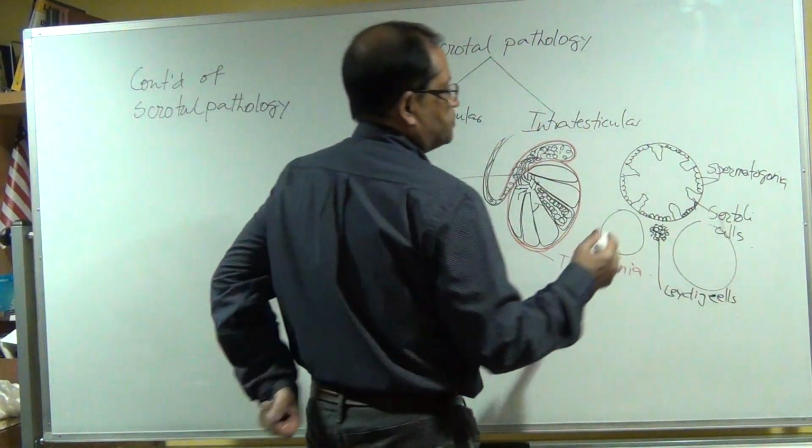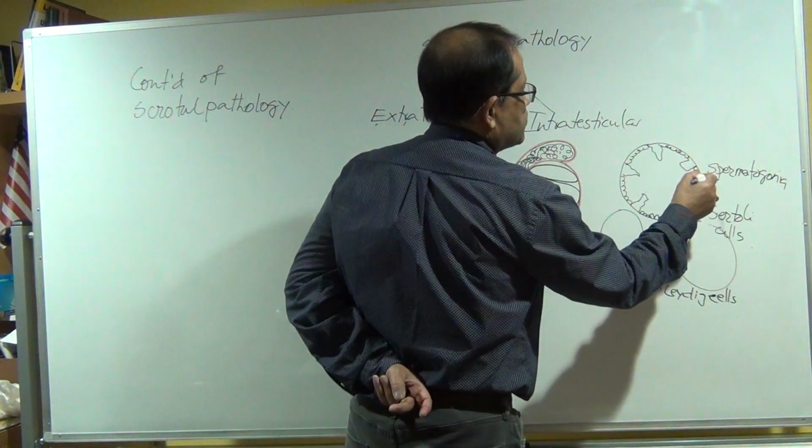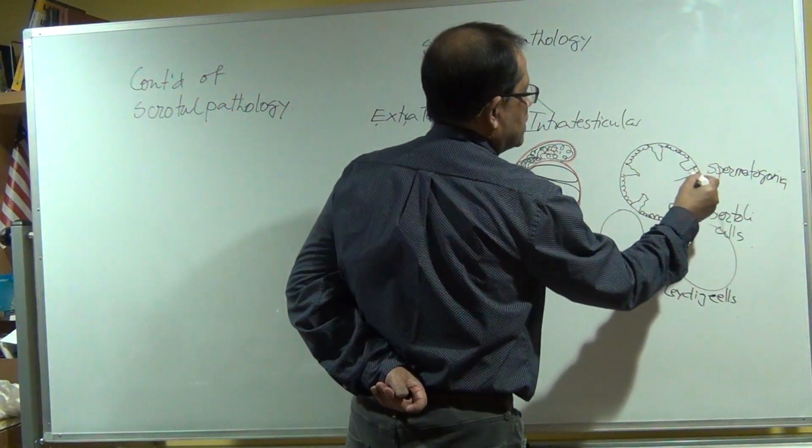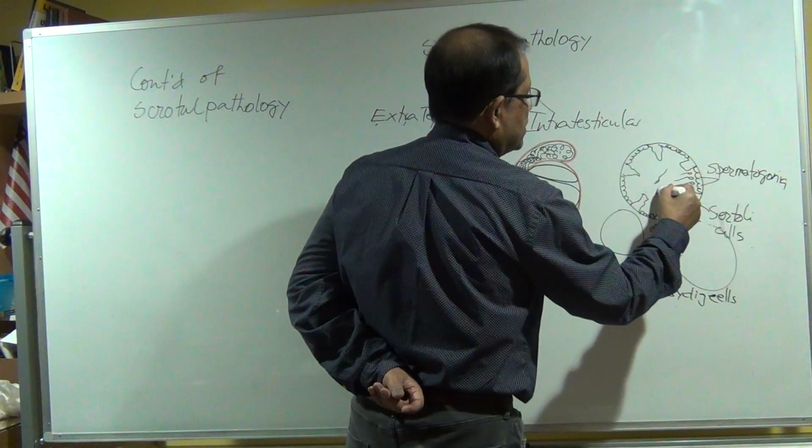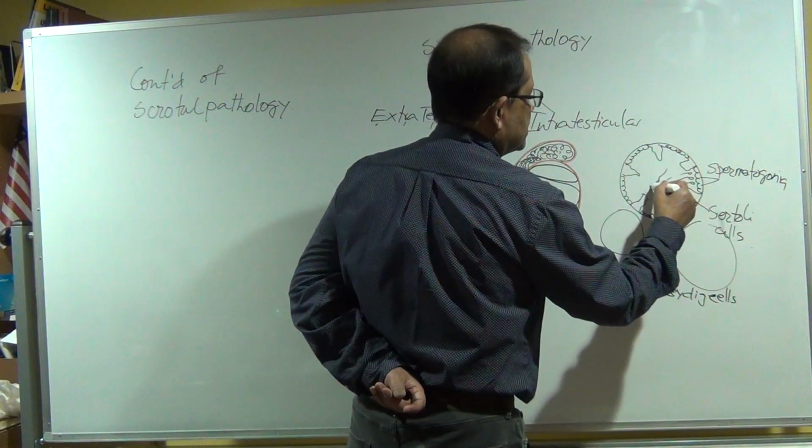So now, sperms will be produced from here, and then mature sperms will be in the center.